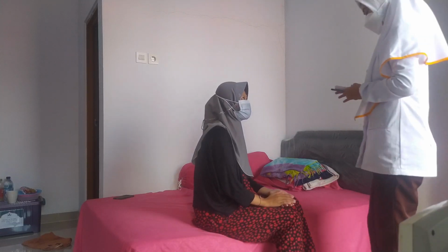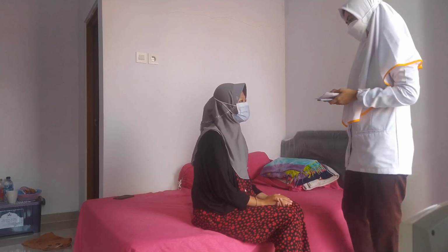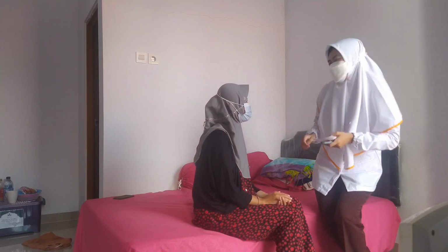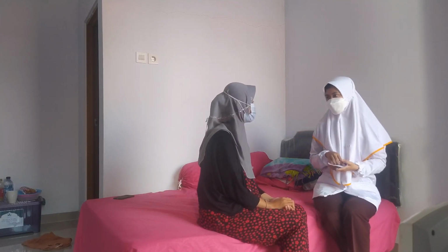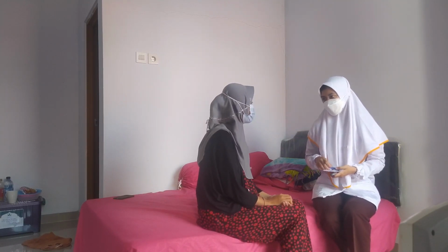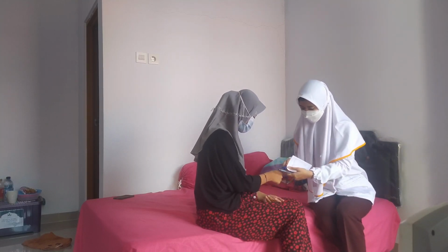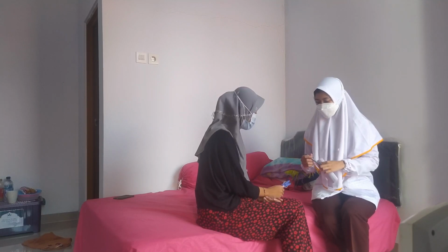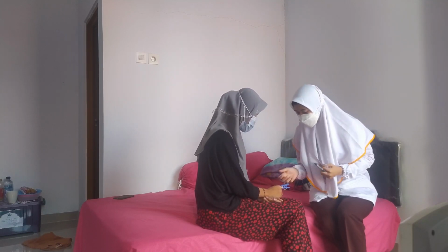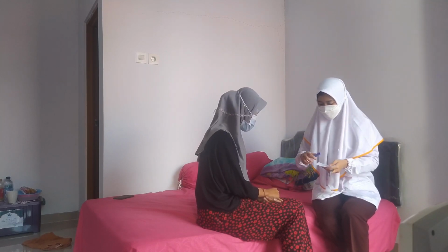Good morning, Mrs. Anissa. Good morning. How are you feeling today? I feel good. Okay, it's time for me to check your oxygen saturation. Okay. Put out your finger for me, please. Sure. Oh, your oxygen saturation is 98%.